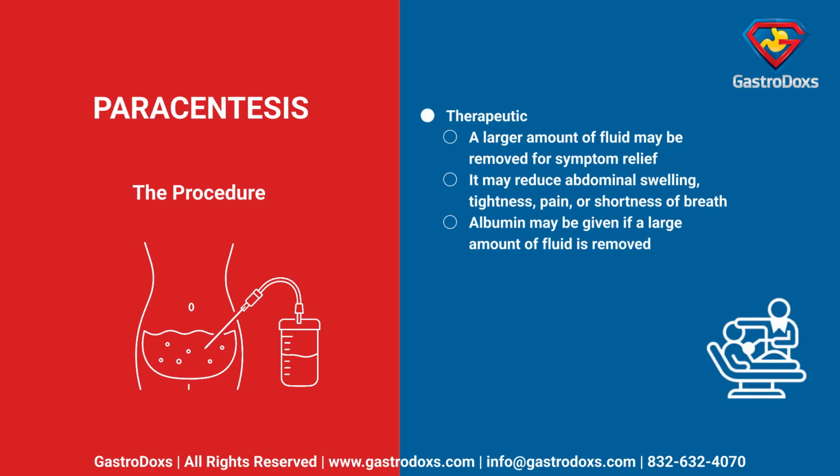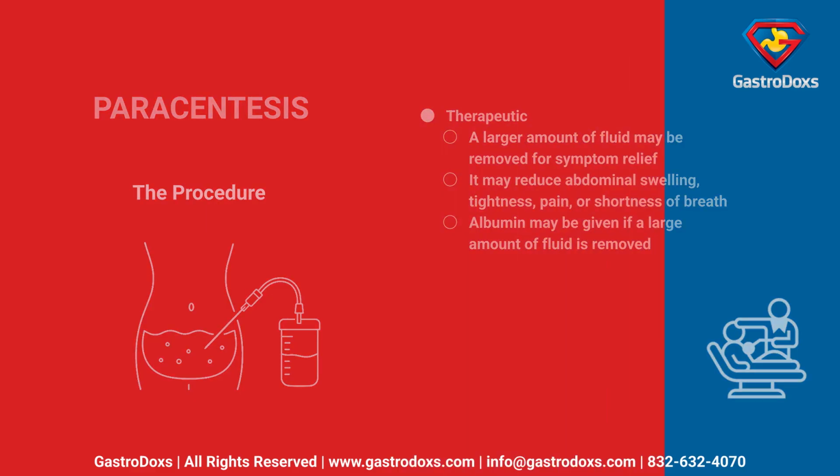Therapeutic. A larger amount of fluid may be removed for symptom relief. It may reduce abdominal swelling, tightness, pain, or shortness of breath. Albumin may be given if a large amount of fluid is removed.